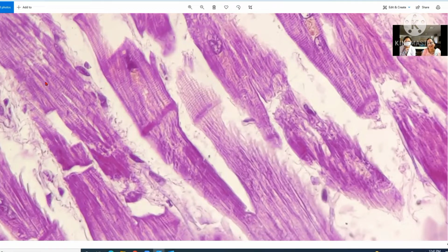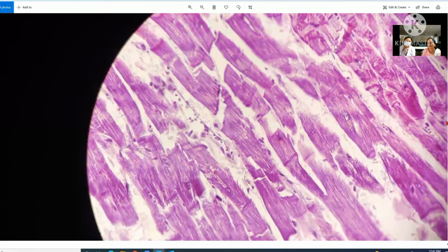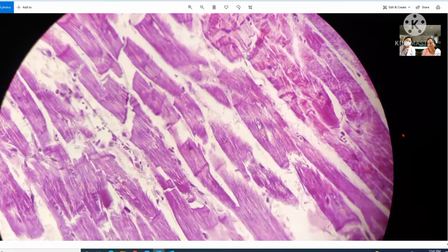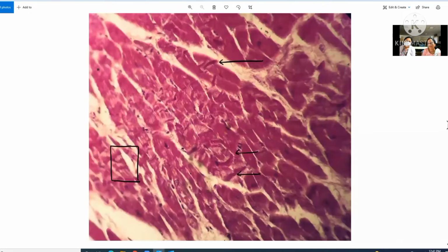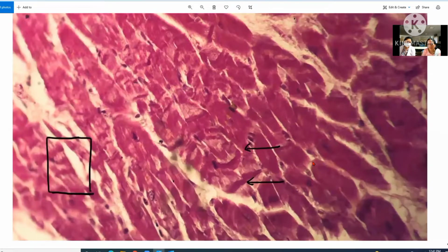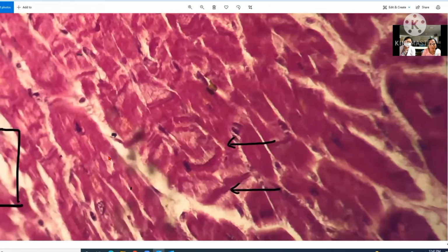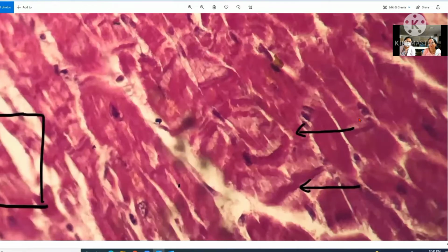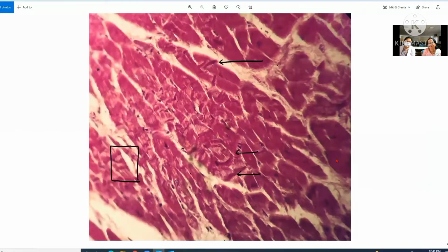Yes, for the striations. So the important feature is this, which was catchy. Yes, we keep seeing it, but still, we thought let us talk about it. We'll move on to the next picture. This is what Nazma has marked for identification. Everybody would have identified by this time.